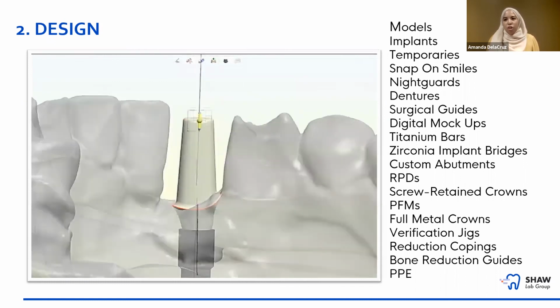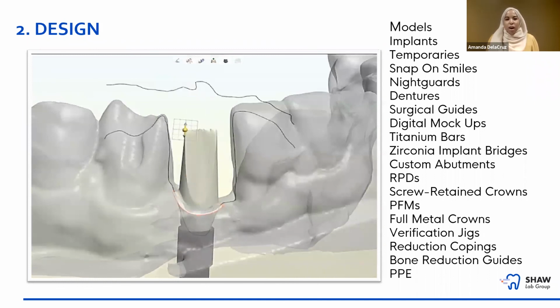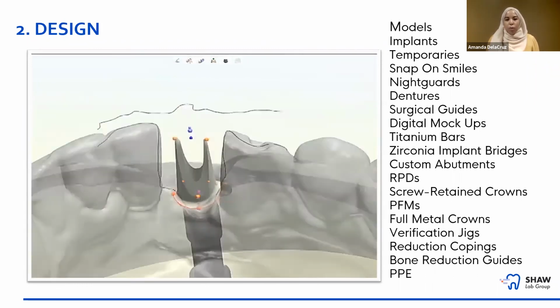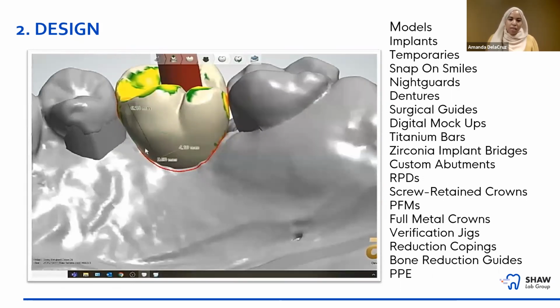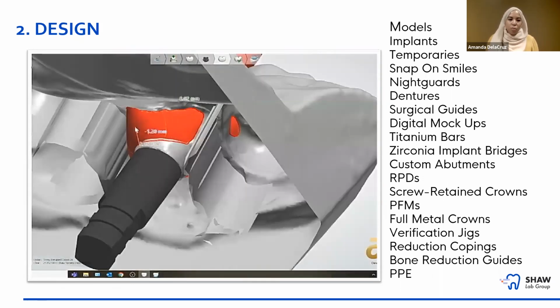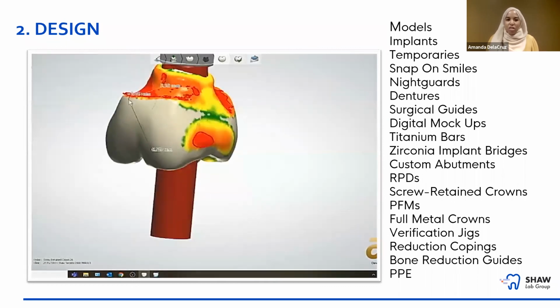When we design, there is also the issue that we're working with manufacturing parameters. So you might want to make it more tapered or more sharp or narrower, and the manufacturer doesn't allow it because it's too thin to produce in a stable way, and so that it's going to last and be covered under the warranty. So we always have those considerations in mind.